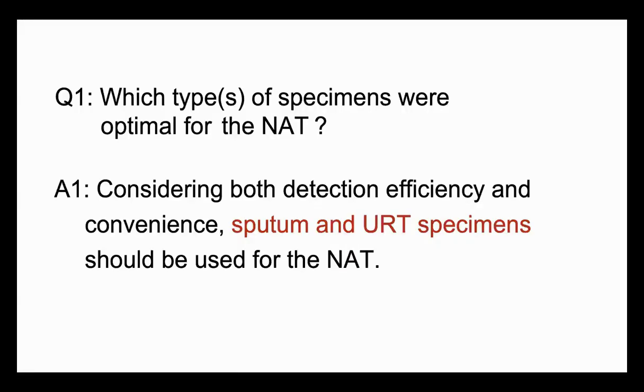So, according to our results, and considering both detection efficiency and convenience, sputum and upper respiratory tract specimens should be used for nucleic acid testing.